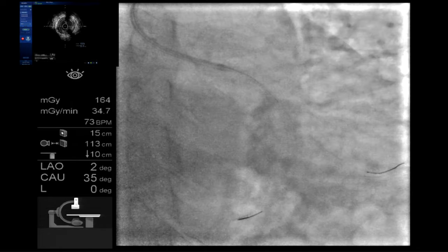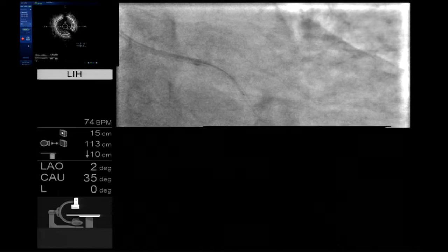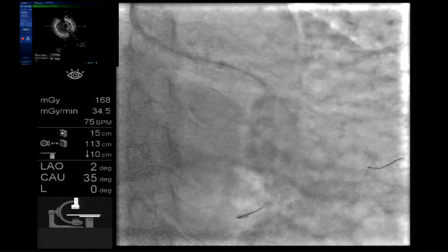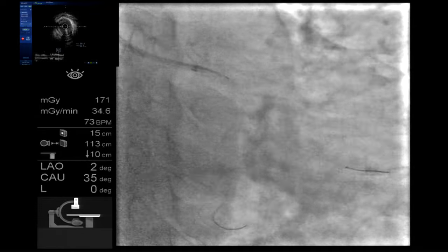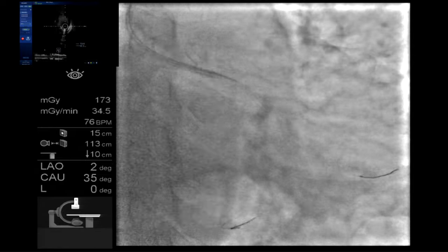It's bigger here now. 1, 2, 3. Yes. About 3.5 here now. That looks like a good landing zone. Right here, all the way. There. It's pretty high up, actually. Pretty okay. Not bad. I'm afraid there's no landing zone. Yes, everything is diseased, lumpy, bumpy everywhere.